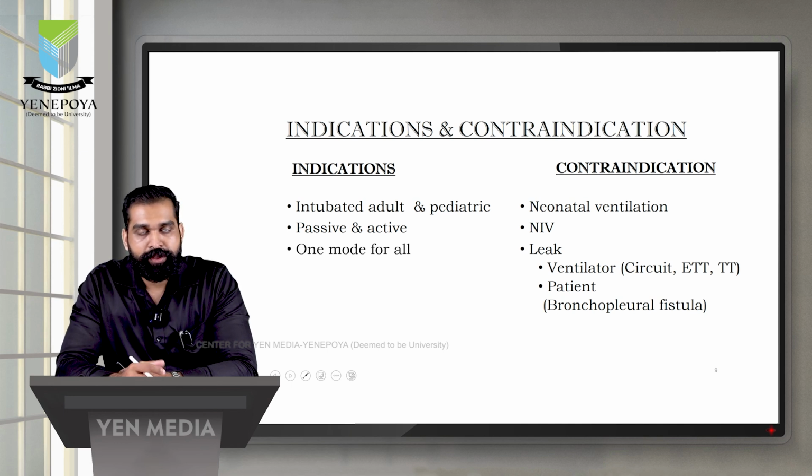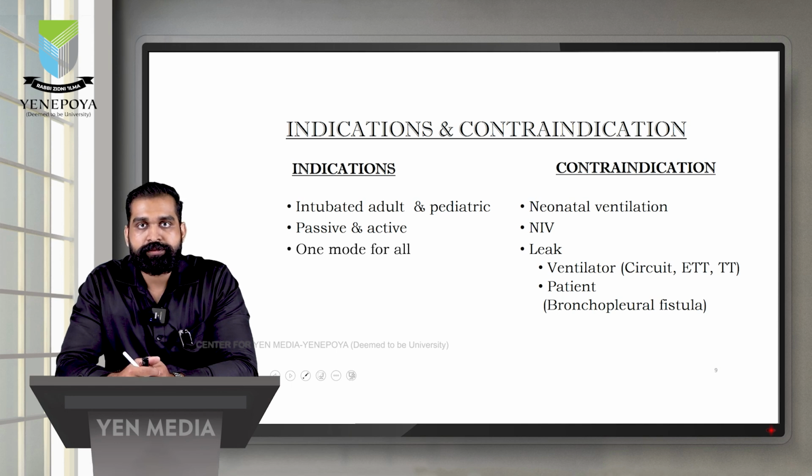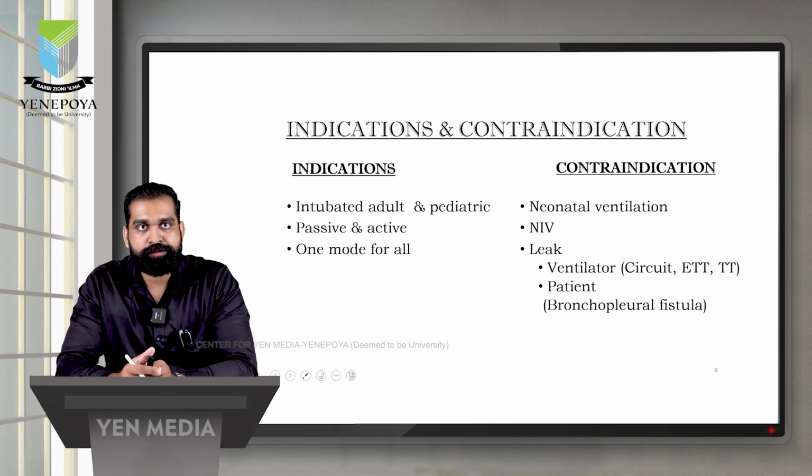Now, if the patient is passive, then the mode will behave something like PRVC. So just to compare how the mode is going to behave in a passive patient to something that you're familiar with, the mode is going to behave like PRVC, where pressure regulated volume control breaths are going to be delivered. The patient is completely passive and no spontaneous breaths are detected. Now, in an active patient, it depends on the respiratory frequency of the patient. If the respiratory frequency of the patient is more than the targeted frequency, then the ventilator is going to act like volume support. If the respiratory frequency is less than the targeted frequency, then the ventilator will allow the patient to breathe intermittently between the mandatory breaths, acting like SIMV.